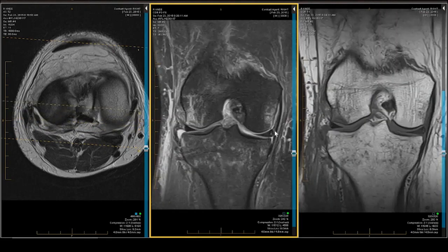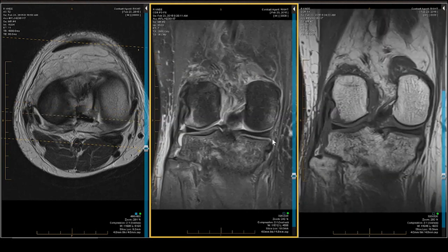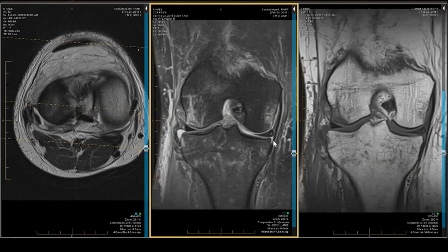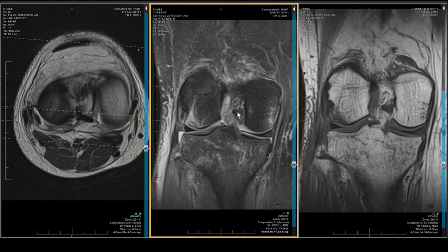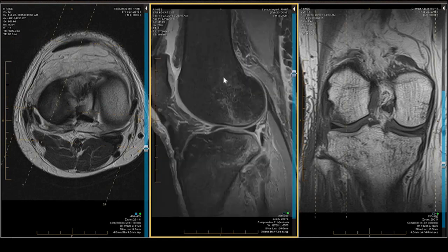Let's briefly look at the posteromedial corner, which has a little swelling. The middle layer of the MCL and tibial collateral ligament are normal, the superficial layer is normal, the meniscofemoral ligament is normal, and the meniscotibial ligament is visible and present and accounted for.